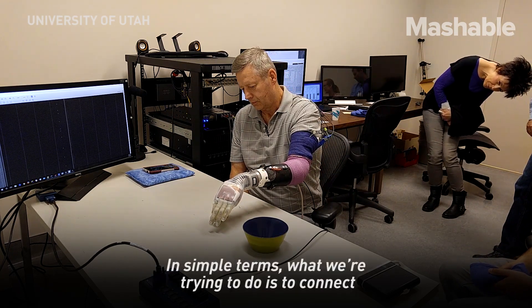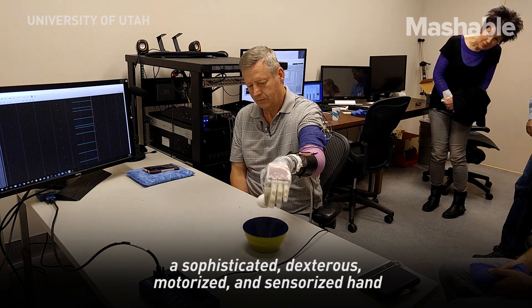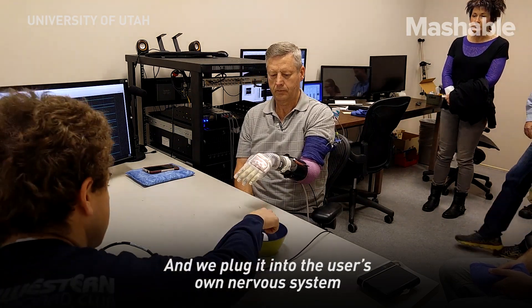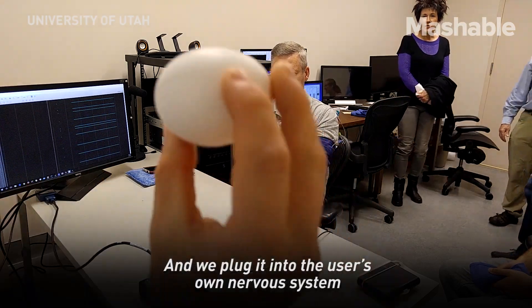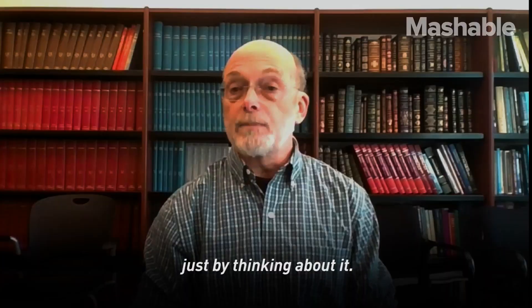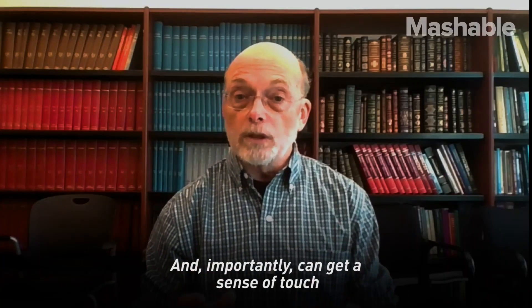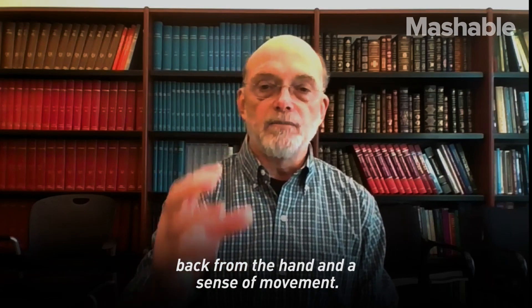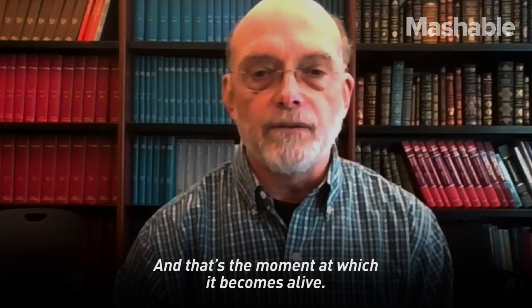In simple terms, what we're trying to do is to connect a sophisticated, dexterous, motorized and sensorized hand, and we plug it into the user's own nervous system and neuromuscular system so that the person can move this complicated hand just by thinking about it, and importantly, can get a sense of touch back from the hand and a sense of movement. And that's the moment at which it becomes alive.